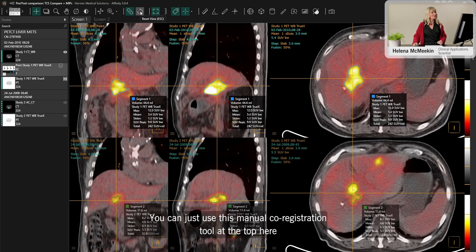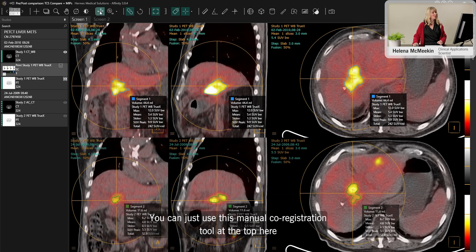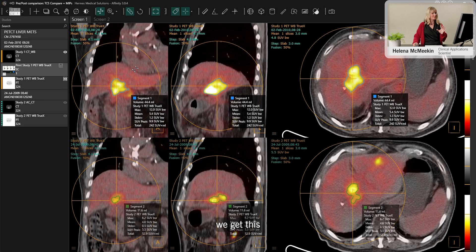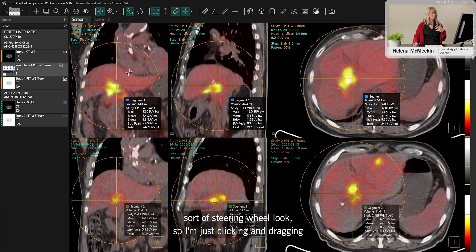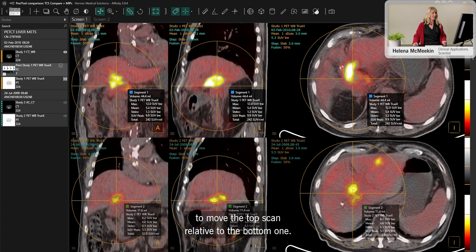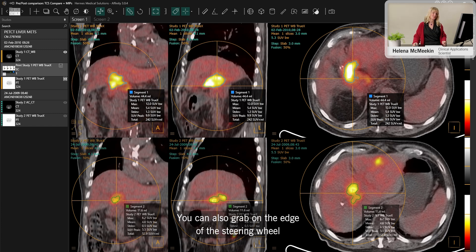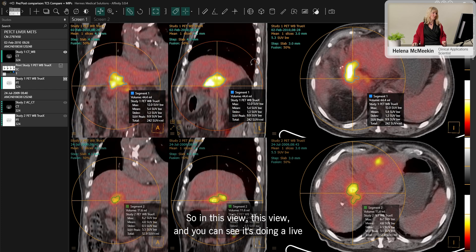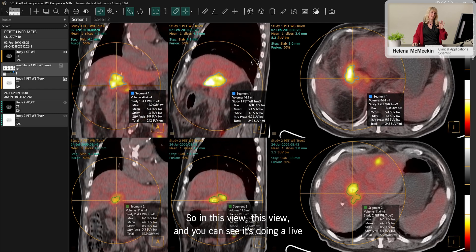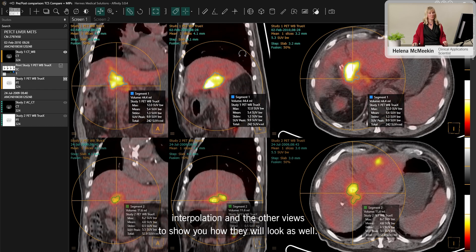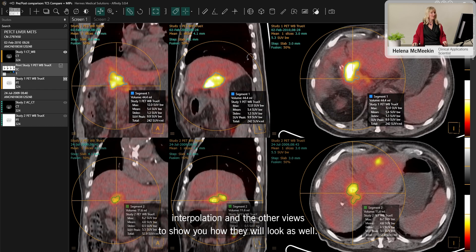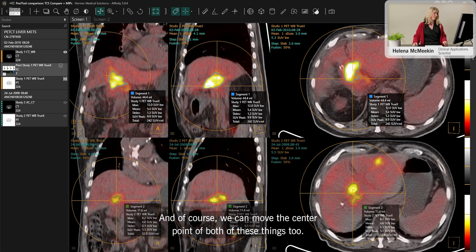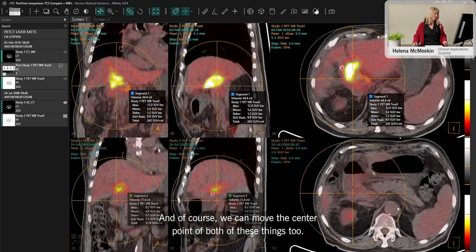If focused registration doesn't do the job, we also have full manual registration. Using the manual co-registration tool, you get a steering wheel interface — click and drag to move the top scan relative to the bottom, or grab the edge of the steering wheel to rotate in any of the views. It performs live interpolation in the other views to show you how they will look, and you can also move the center point.